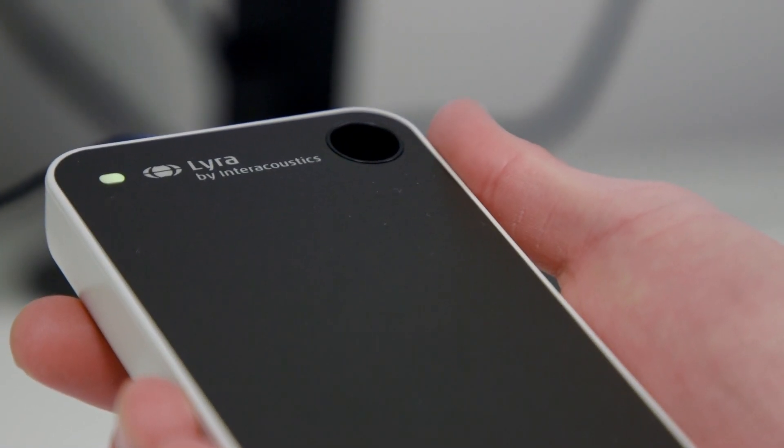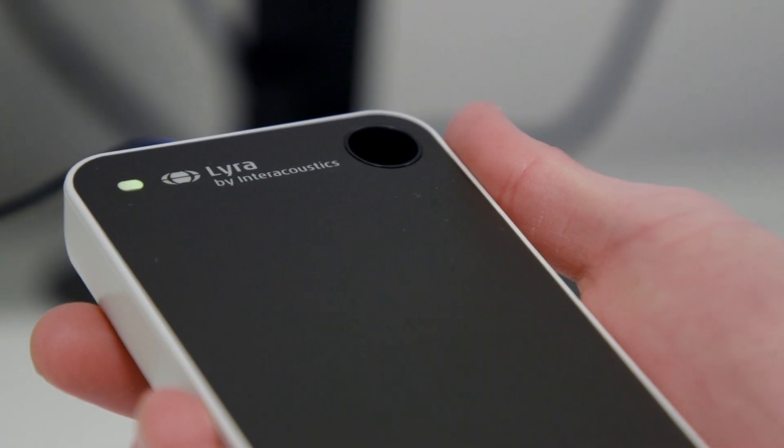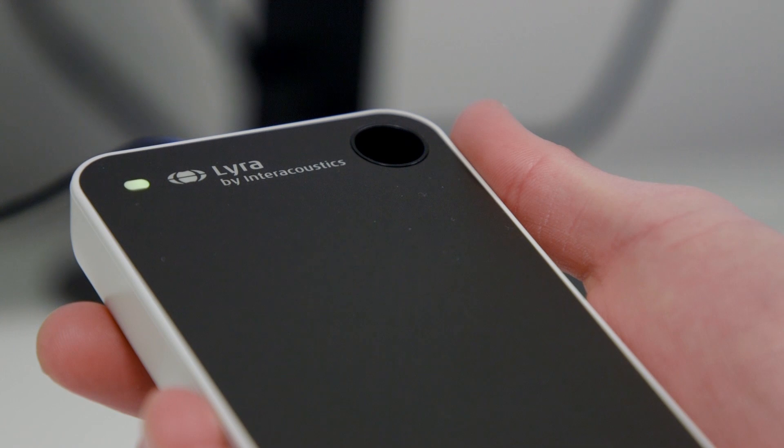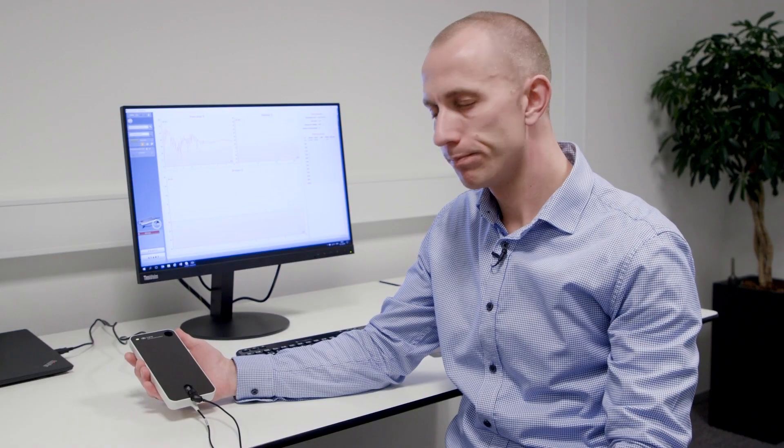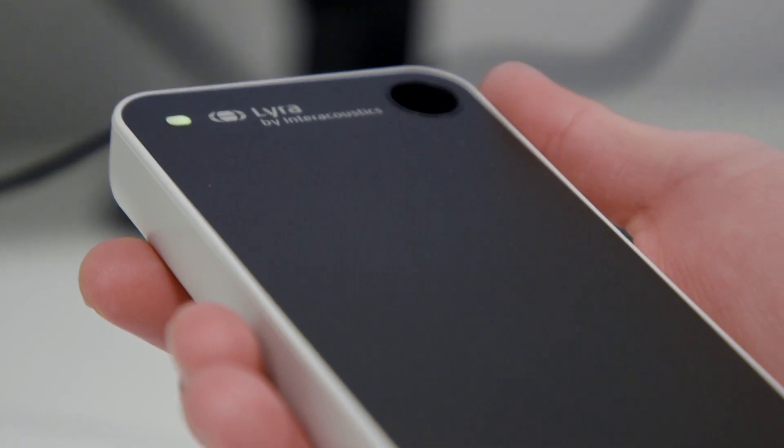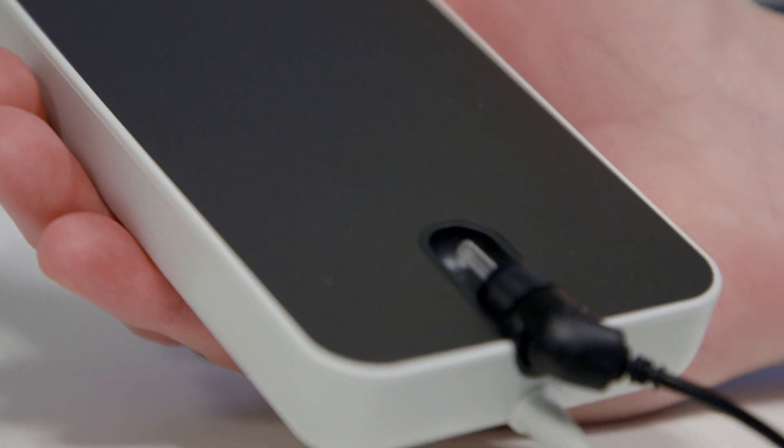The Lyra is our first dedicated product for clinical OAE. It is a black box, meaning that it's to be run via the PC.